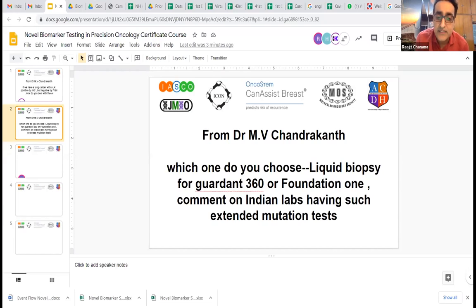As far as liquid biopsy is concerned, we know that the concordance rate is around 60 to 80% as compared to a solid tumor. But as far as the choice is concerned, it would be Foundation One since it is FDA approved. I'm not sure about Guardant 360 whether it's FDA approved or not. So my choice would be Foundation One, and definitely we have Indian labs also, which are offering the extended mutational test, especially targeted gene panel and whole genomic sequencing. We also have plenty of experience with these labs.